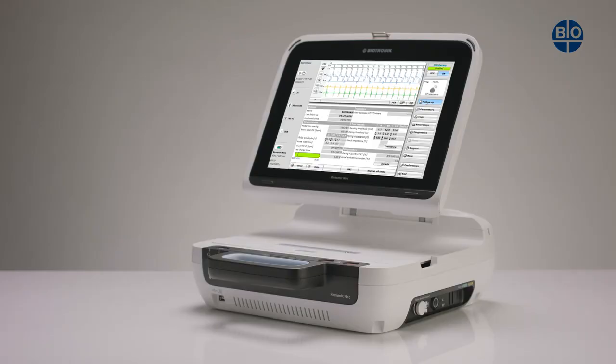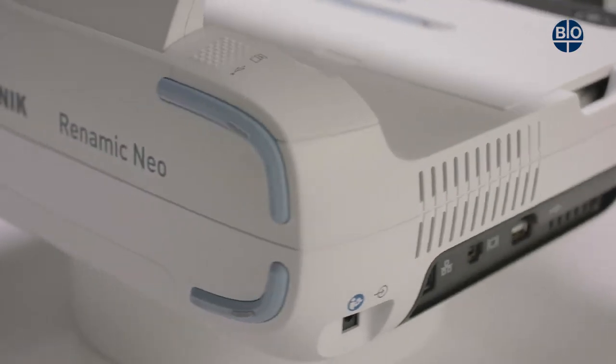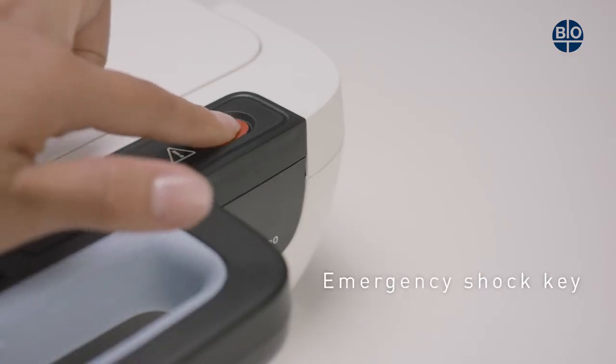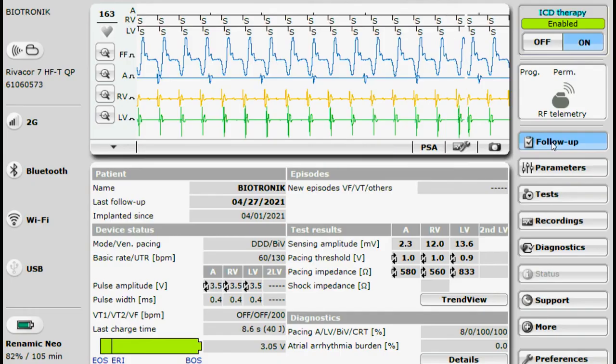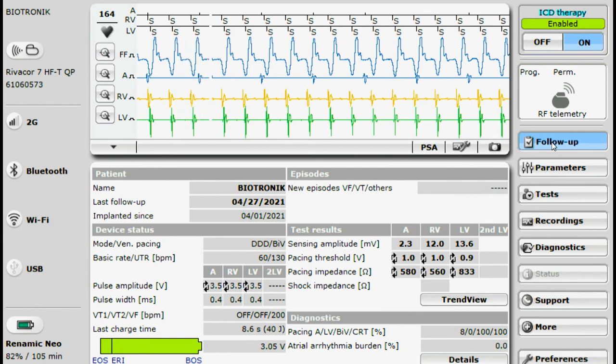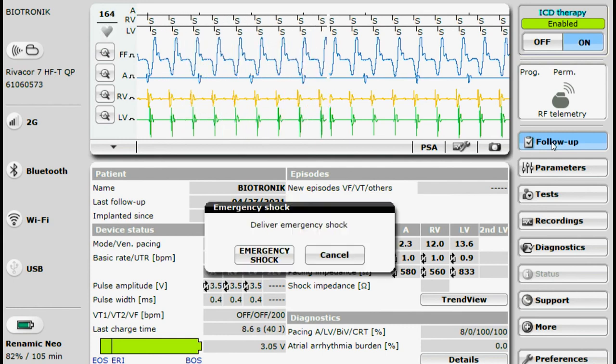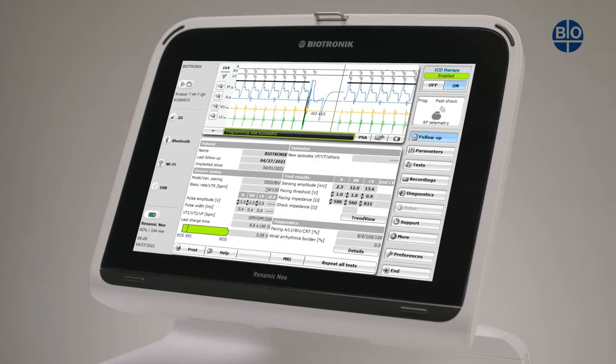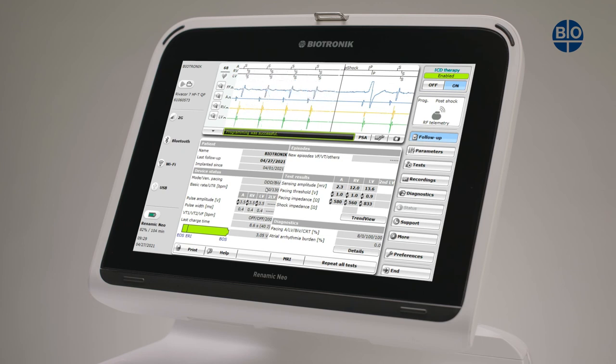If a patient has a tachyarrhythmia in the event of an emergency during treatment, it is possible to actively terminate this event by triggering an emergency shock. Pressing the emergency shock key will result in the emergency shock parameters being activated. For safety reasons, a dialog also gives the user the option of cancelling the action. After an emergency shock is triggered, the previously set programming of the implanted device becomes active again.